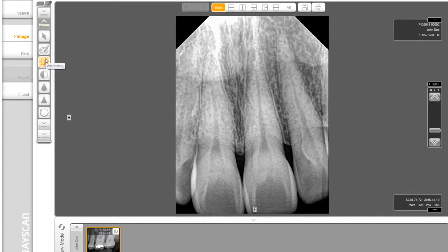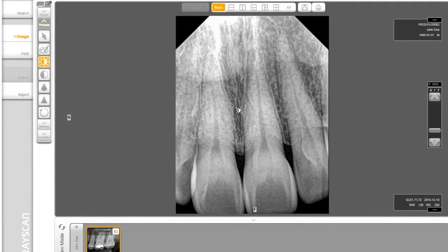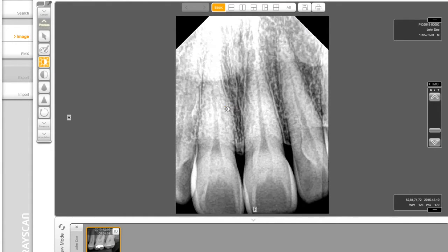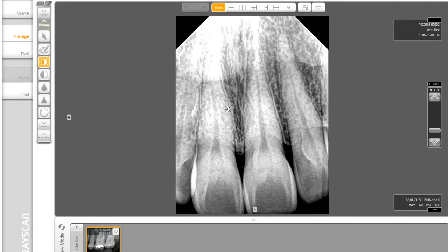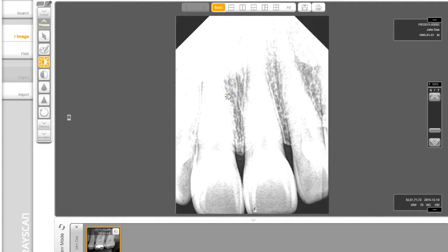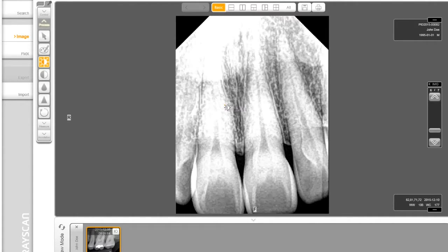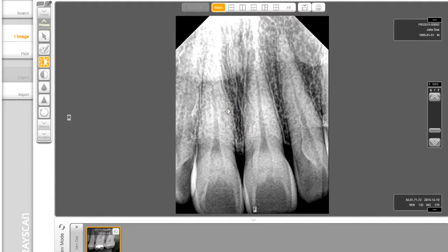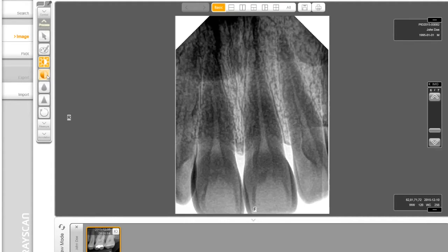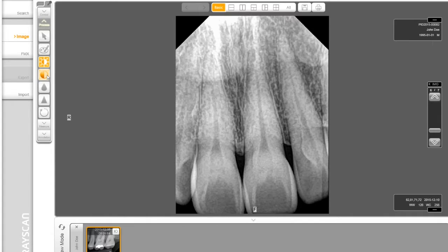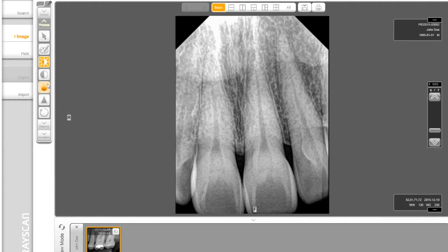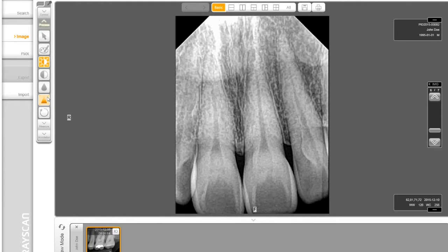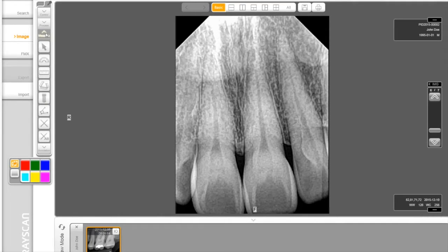The next section is process tool. Windowing button allows the user to click and drag on the image to adjust the brightness and contrast. Dragging left and right adjusts the contrast, and dragging up and down adjusts the brightness. Invert makes whites to black and blacks to white. You also have sharpen and median options.